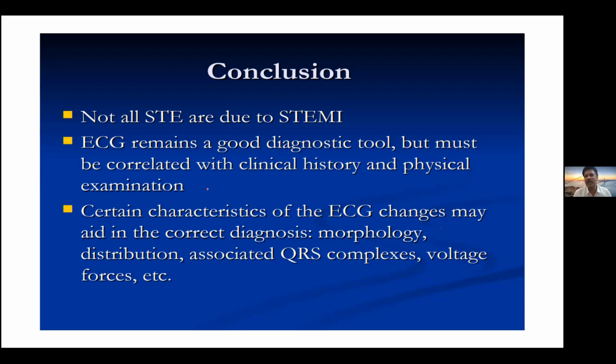A patient comes for a health checkup, young age, 25 years, athletic build, with bradycardia and atypical chest pain. The ST segment appears to be elevated and the J point is elevated with concavity upwards. You diagnose benign early repolarization syndrome rather than an acute MI. So clinical history is very important. And if it is not correlating, then your diagnosis is wrong. So go by the clinical history and correlate the ECG according to it.